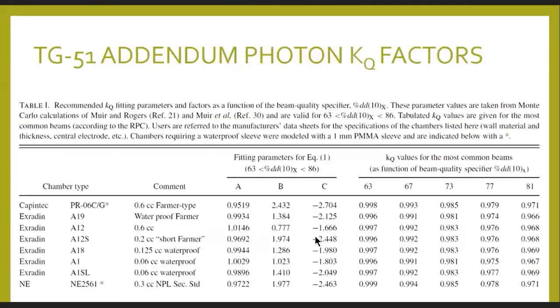Also here, for some of the cylindrical chambers the KQ values are not given in the old TG51, the original protocol; they are given in the TG51 addendum.